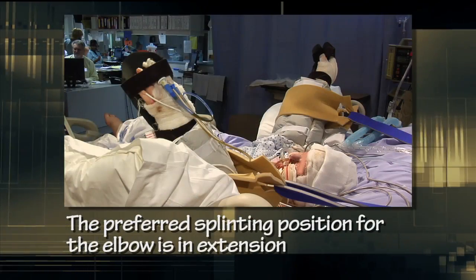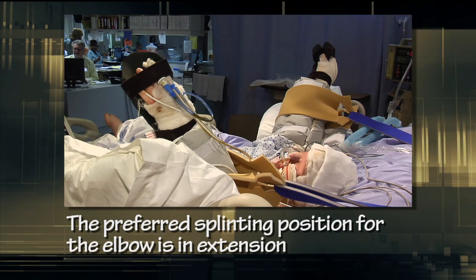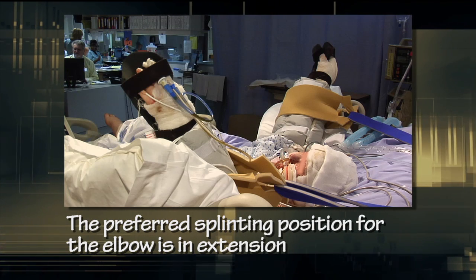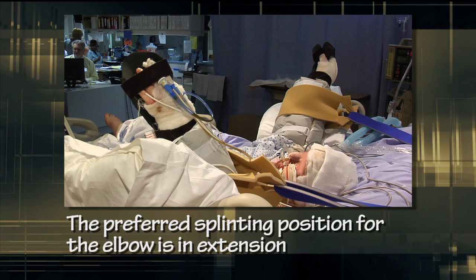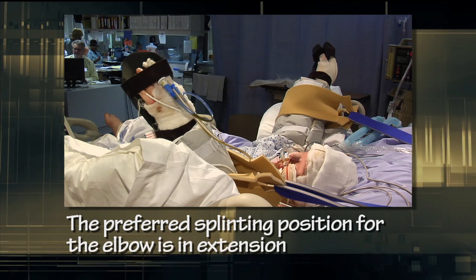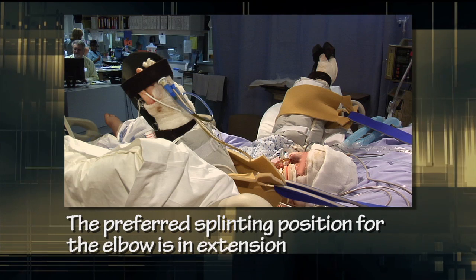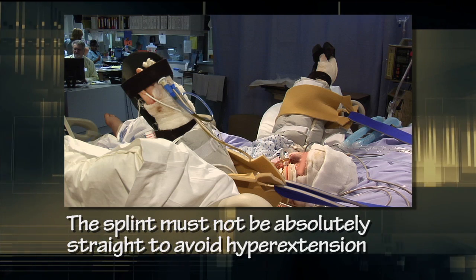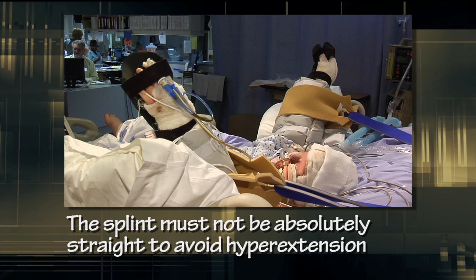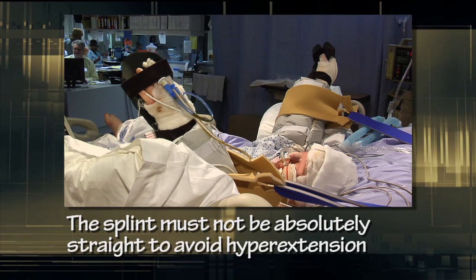The preferred splinting position for the elbow is in extension. This is accomplished with an anterior or posterior splint extending from the proximal 1/3 of the arm to the distal 1/3 of the forearm. During splint manufacturing, the patient is asked to hold the elbow in full extension with the forearm neutral. The splint must not be absolutely straight to avoid forcing the elbow into hyperextension with forearm supination.